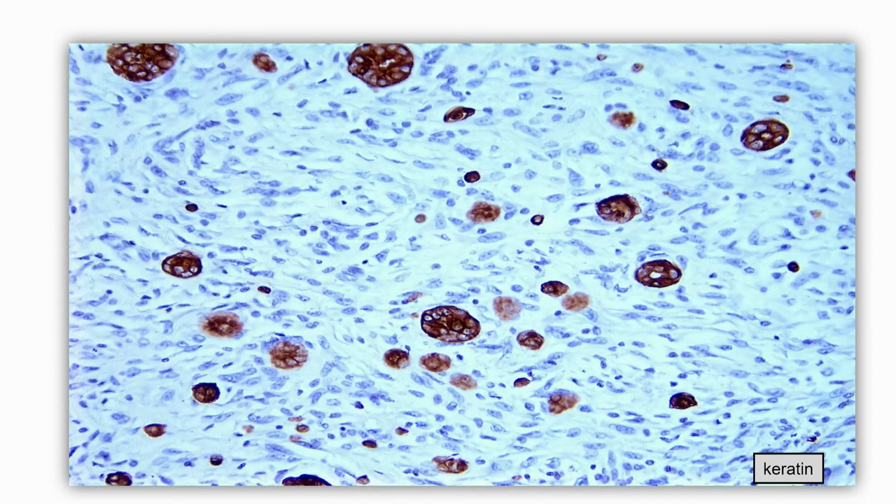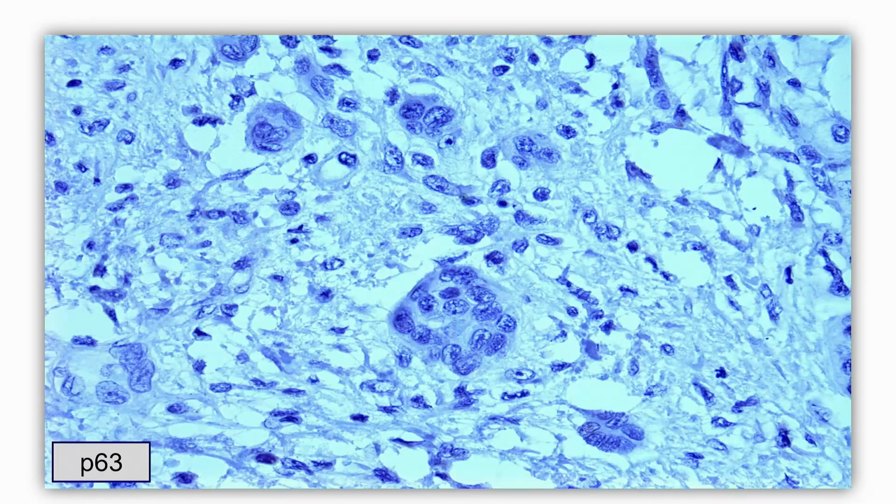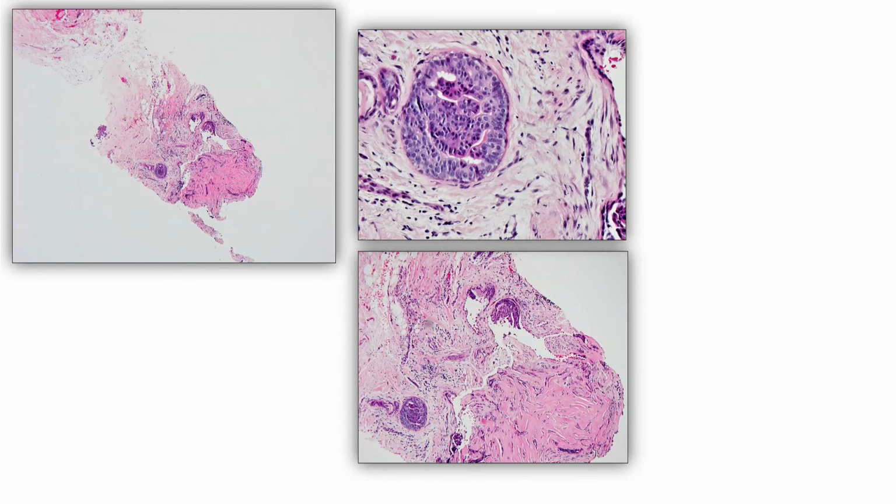And certainly if you do immunostains, that will reinforce that mistake, because here you see lots of single keratin-positive cells, no p63 staining, and so that might reinforce your impression of invasive carcinoma. Here's a fairly recent case of a core needle biopsy of a targeted mass, and you can see there's this sort of sclerotic area here. There is a little bit of epithelial proliferation, which I think has slit-like spaces and kind of a heterogeneous appearance.